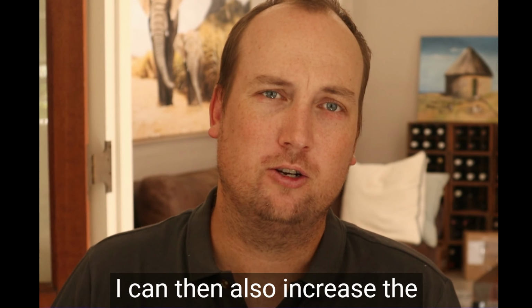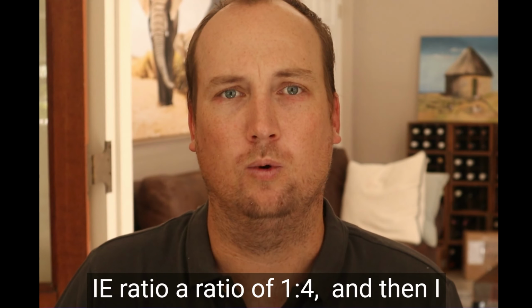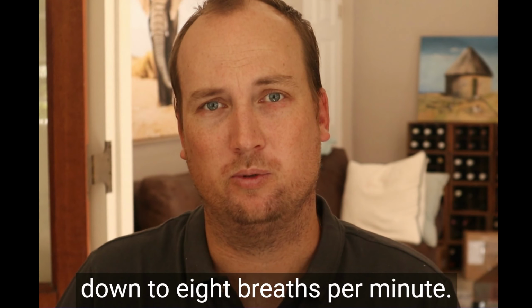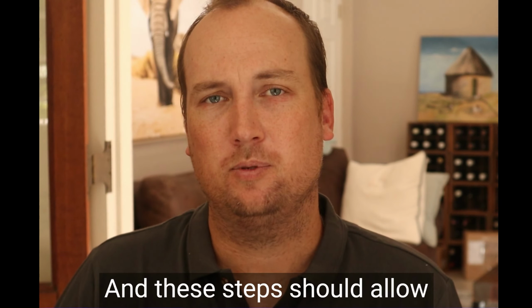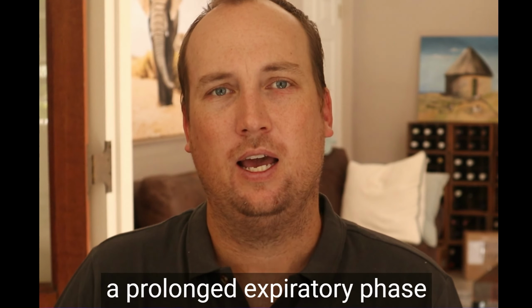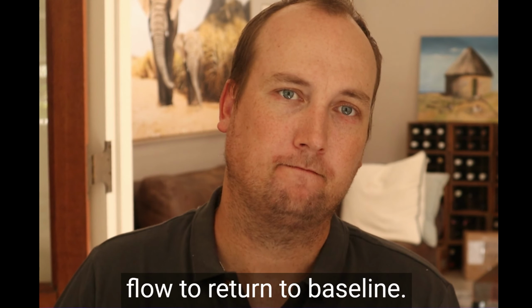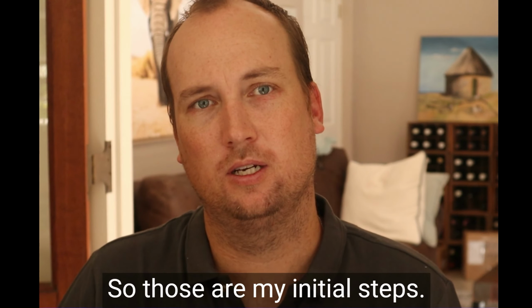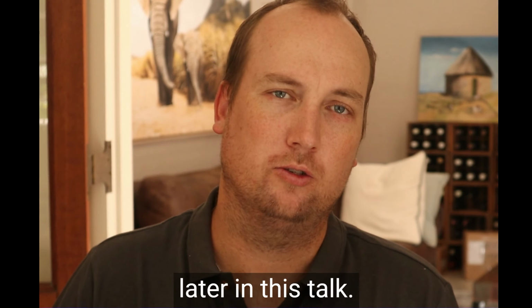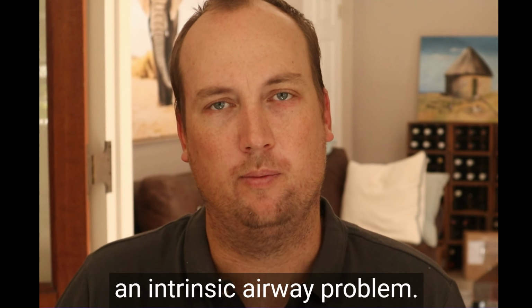I can then also increase the expiration time by making my IE ratio a ratio of 1:4. And then I slow the dialed in respiratory rate down to 8 breaths per minute. And these steps should allow a prolonged expiratory phase, and it should allow expiratory flow to return to baseline. So those are my initial steps. I'll go through the full bronchospasm management later in this talk. So that was if we suspect an intrinsic airway problem.